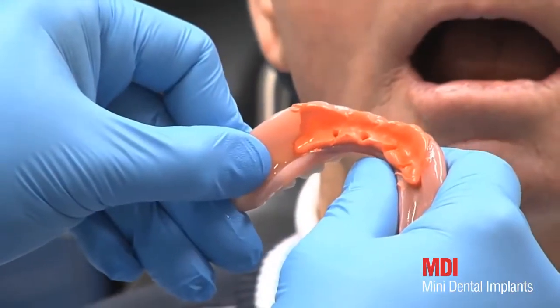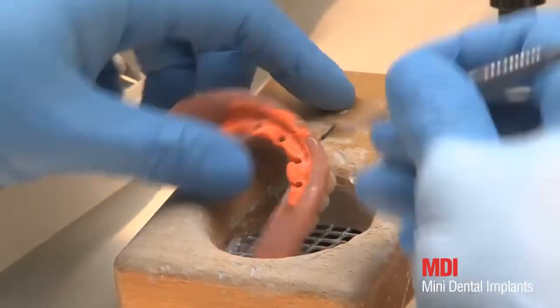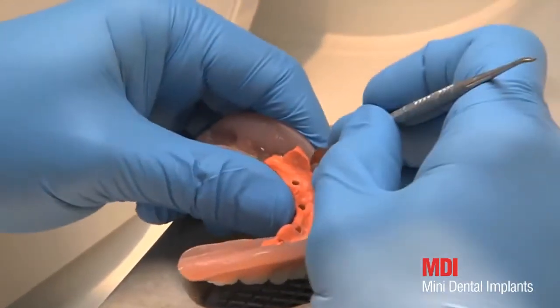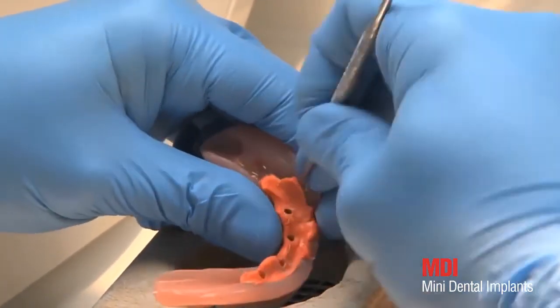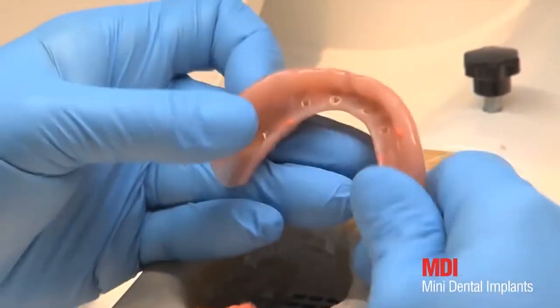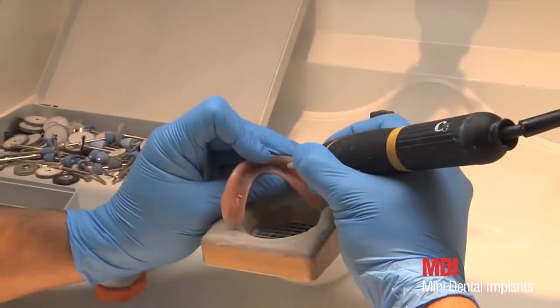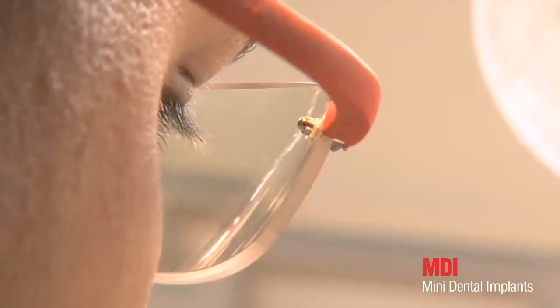The imprints of the ball attachments are now transferred to the prosthetic resin using a burr. Following transfer of the positions, the silicon is removed again. The recesses are extended amply, as per the marked positions, in order to ensure contact-free seating of the metal housings in the prosthesis.